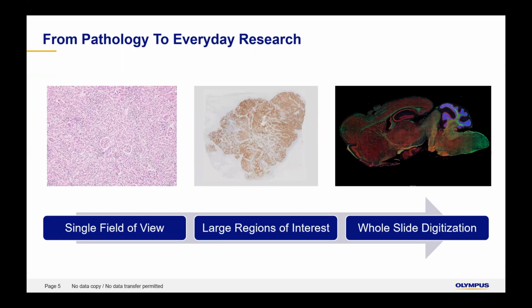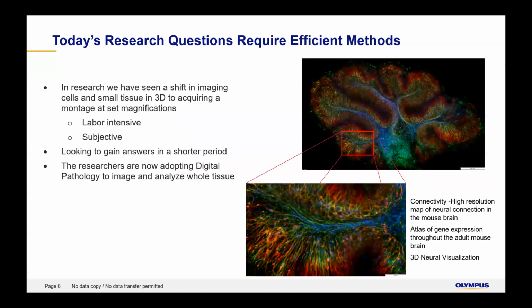This also means being able to image through, say, 75 brain slices changes from a huge project into something that can run overnight while you're sleeping. Not only does this save time, but it dramatically alters the kind of research goals that individual labs can work towards. Now, slide scanning also allows for the digital preservation of slide data.